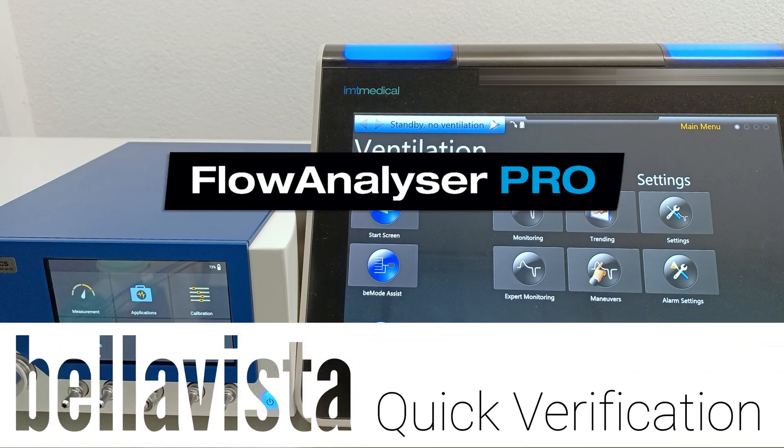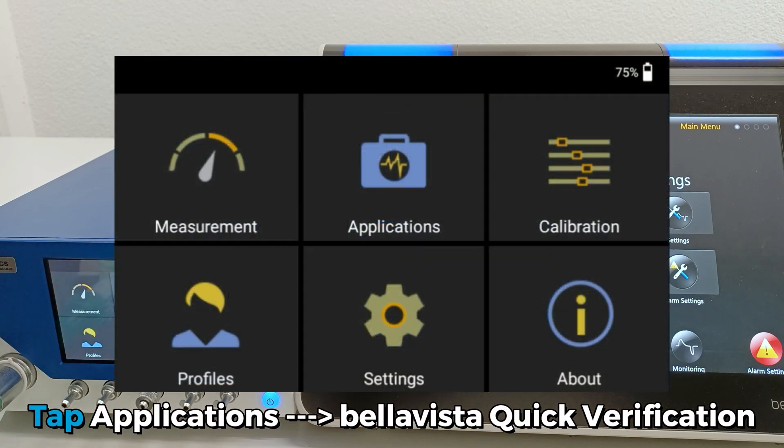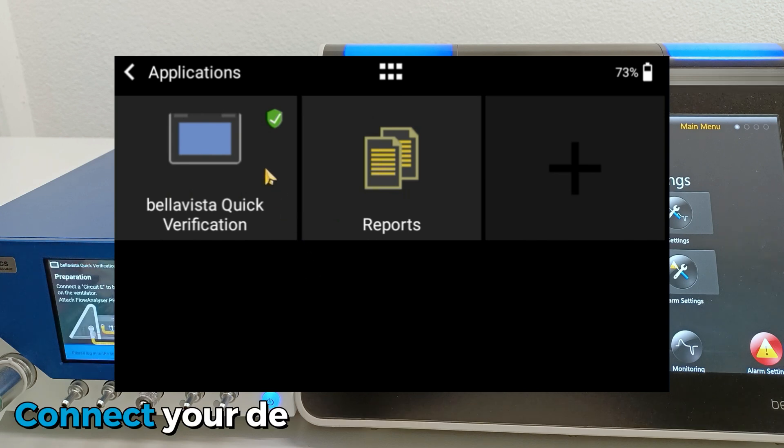How to perform a BellaVista Quick Verification. Tap Applications on the home screen, then tap on BellaVista Quick Verification.